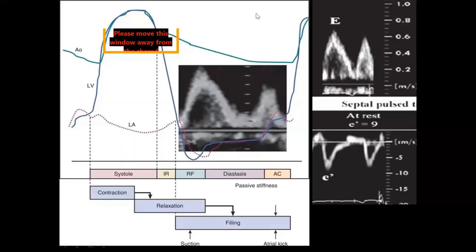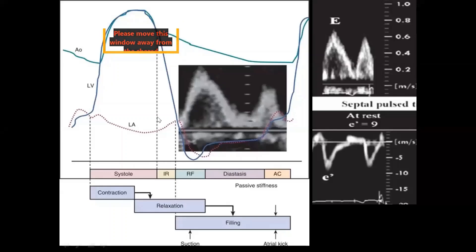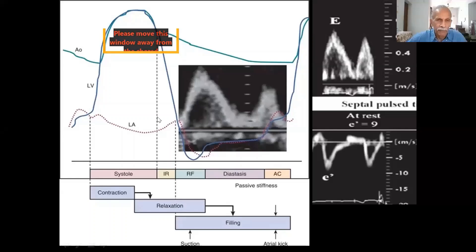At 65, most of the contribution comes from atrial contraction. Below the age of 40-45, most of the volume comes in through early relaxation.